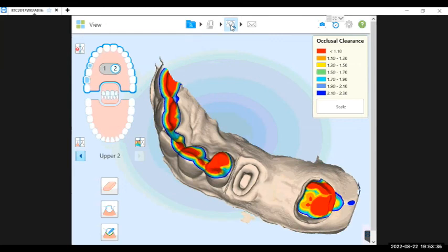Excellent. I think that concludes everything we really wanted to make sure we addressed. Just to recap and provide a little framework for what we're going to review next week, the focus is completely on implants. I'll also review a couple more icons on here. Something we're starting to use more frequently are screenshots as a communication tool for the laboratory. I'll review the process on how to take a screenshot, how to make some notations on it, and send it to the laboratory as well.